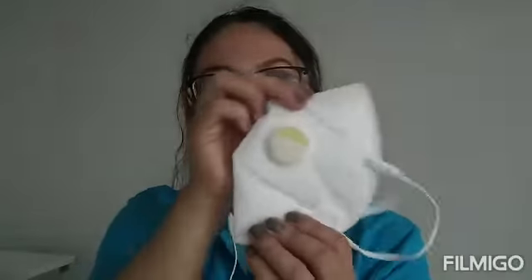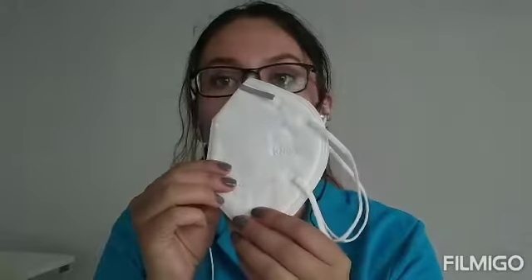For folding masks, the masks that we are more familiar with at the moment are KN95. These masks also divide into medical and non-medical masks, and they come with and without breathing valves. Let me show you what I mean. This one is with a breathing valve, and this one does not have the breathing valve.